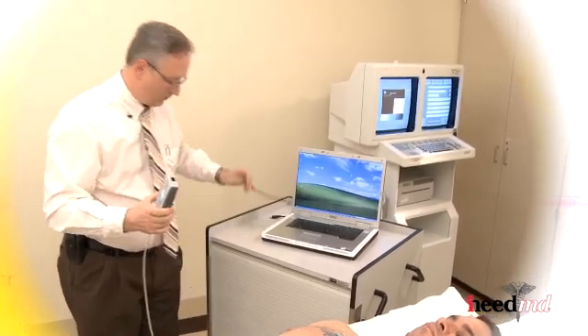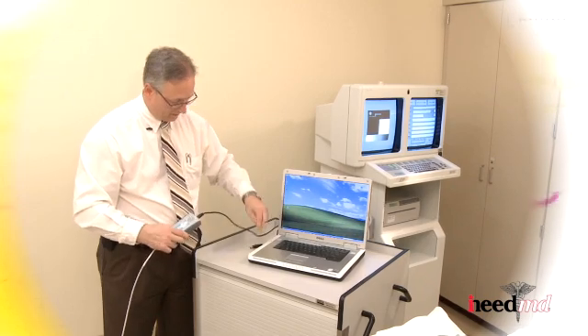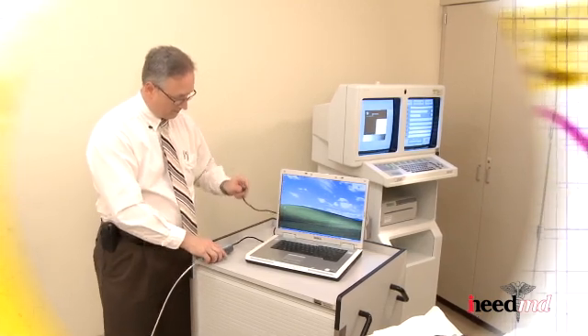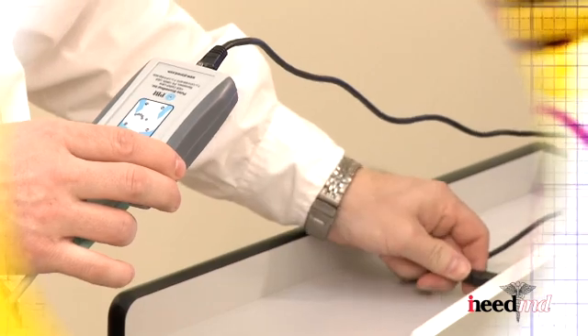The other end of the QRS card should be connected to a jumper cable. The telephone jack end of the cable should be plugged into the QRS card, and the USB cable should be plugged into the computer.